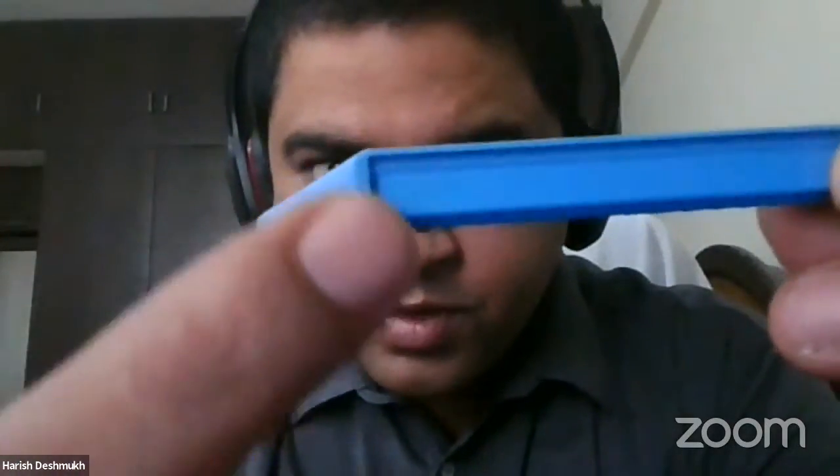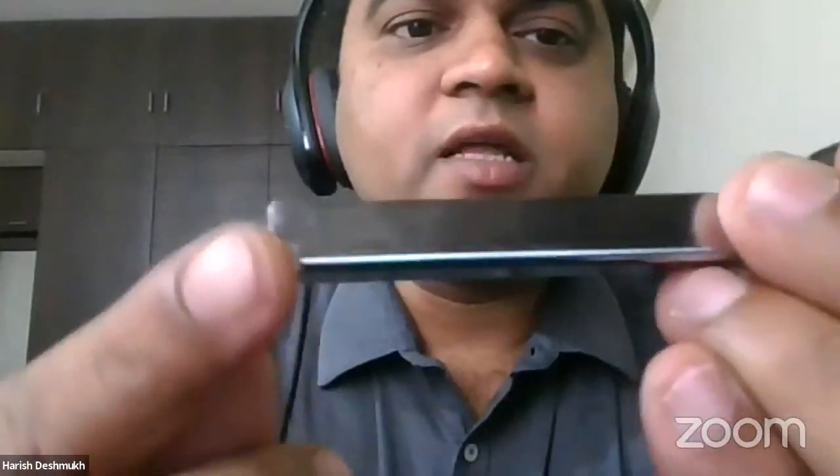Now coming to stapler loading and unloading, which is very important. Every stapler will come with a cap. Here we don't have a cap because I'm using a used reload. When you are loading it, remember there are different grooves in it. You have a groove here, which is supposed to get fixed in the cartridge half in this position. To load, align the two ends together in this way and drop it into the stapler. You'll get a click sound. I hope that click sound was audible.